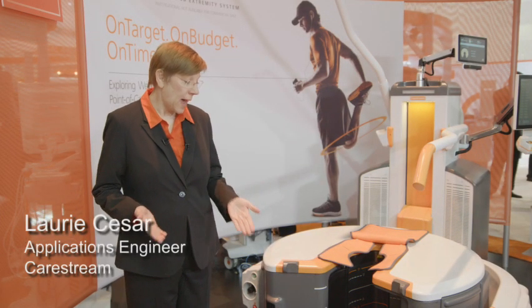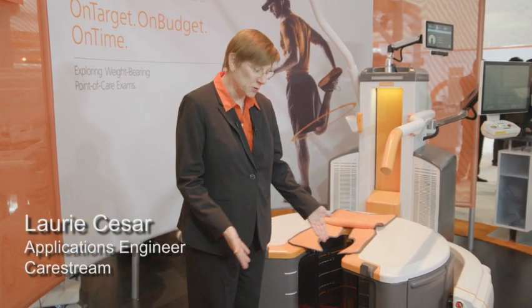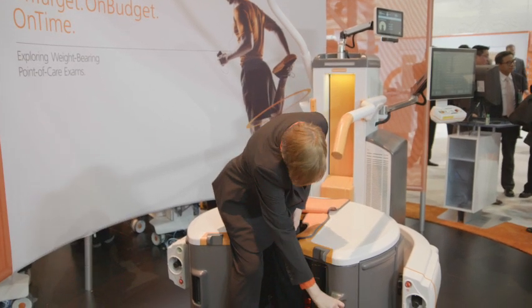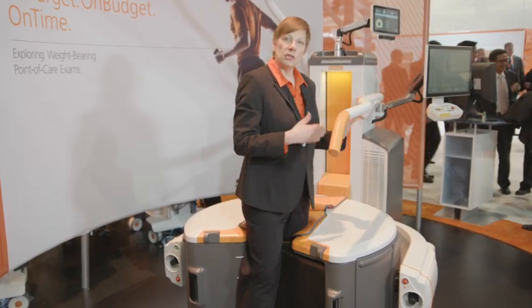One of the unique features that the system has is a door, which makes it easy for the patient to be positioned. I only need to glide the patient in and then I can close the door so we can do the scan.